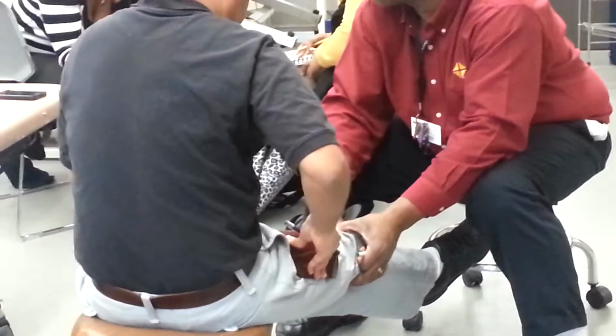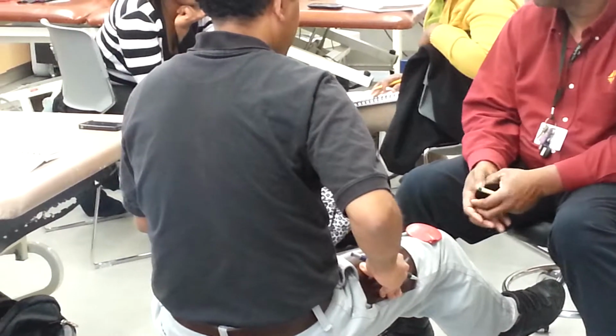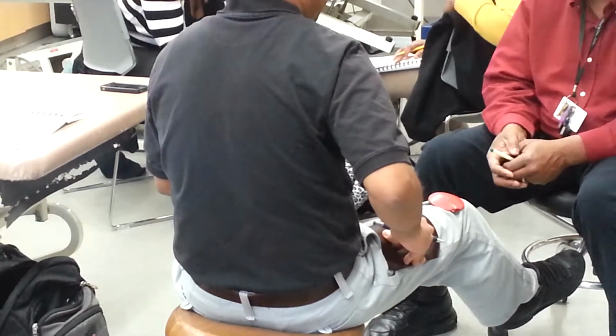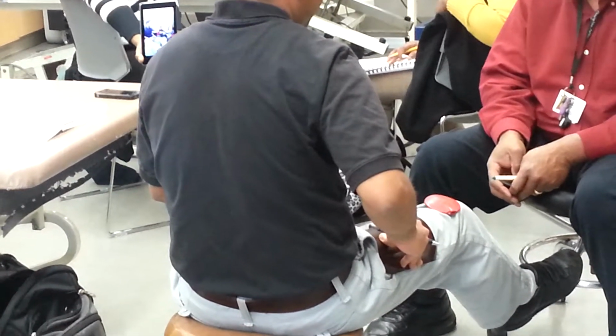Put it right there. All right, let's say I'm doing quad leg. Is that going to work for quad leg? And if not, why not? Because they are too close. No. They are not the same size. You're not going to get motion. Why? Because you're using a monopolar setup, and you need a bipolar. You need a bipolar setup.